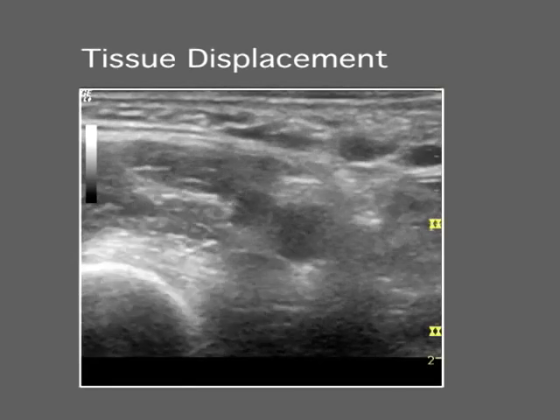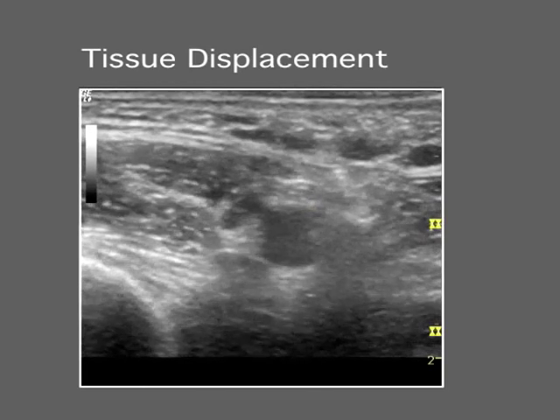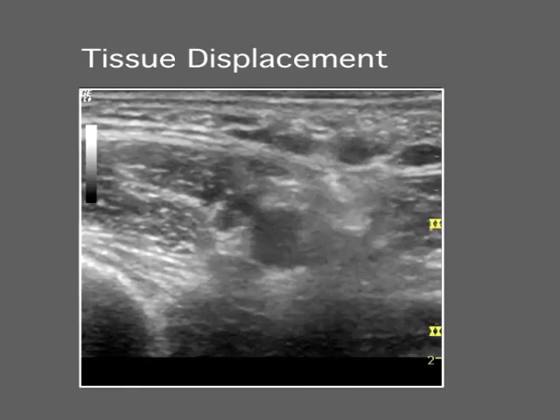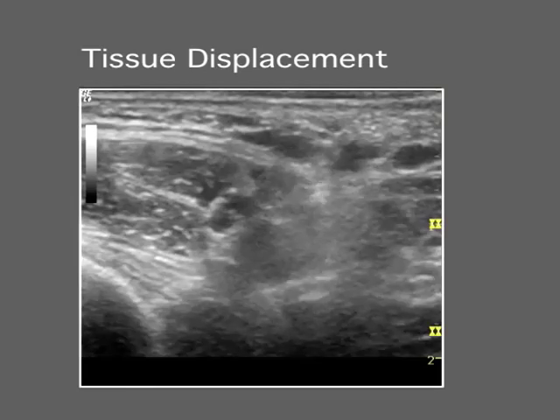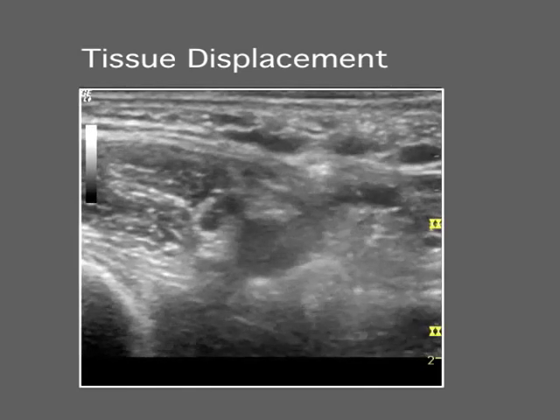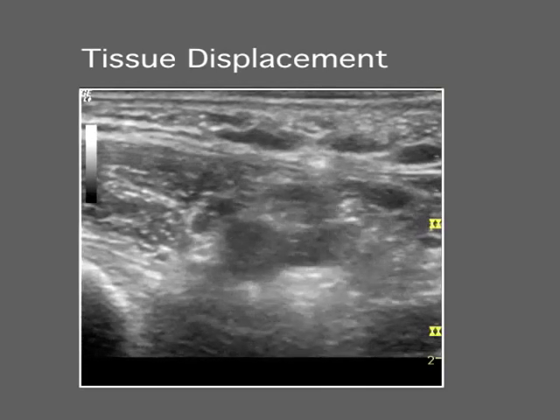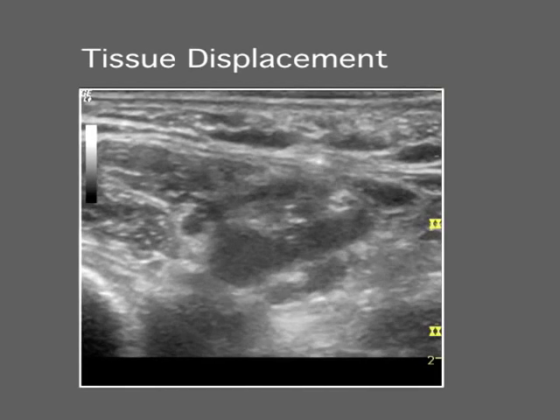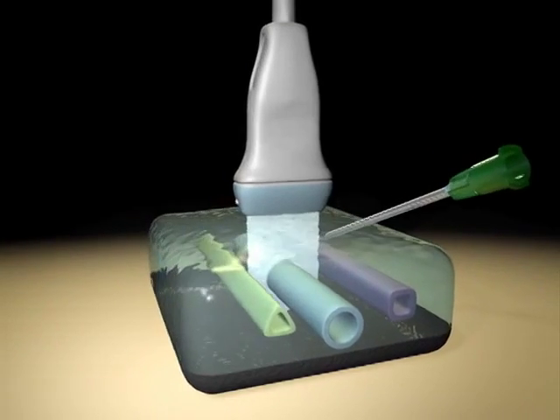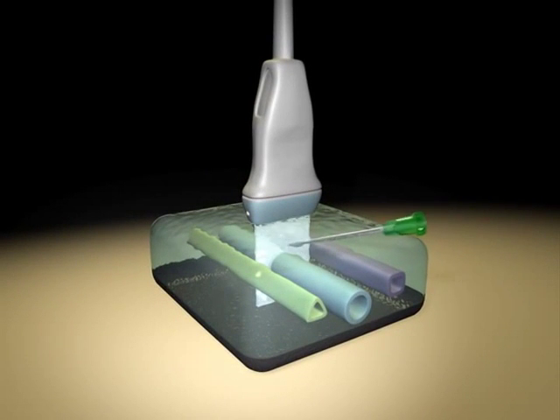Generally, tissue displacement is transmitted far enough along tissue planes for the operator to get a sense for the trajectory of the needle. This is a dynamic process and relies on the operator's ability to detect tissue displacement created by needle movement. Staccato movements should be avoided. Needle position can also be inferred by observing the distribution of small test injections and making needle adjustments. Often, slight tilting of the probe can be used to locate and follow the advancing needle tip.